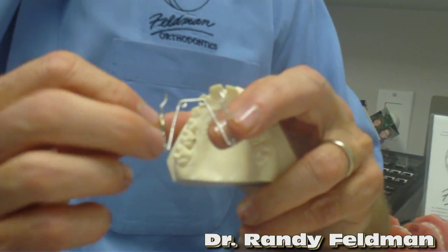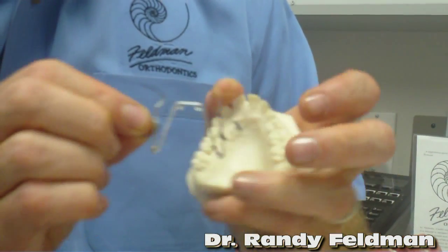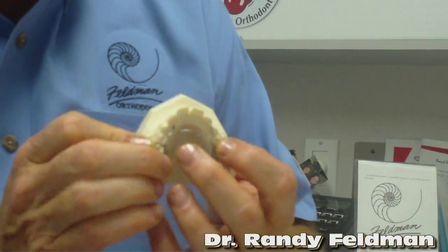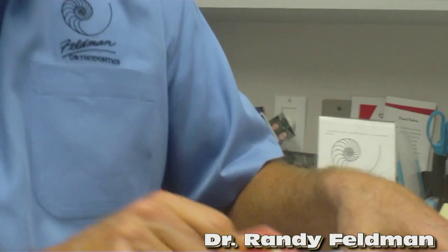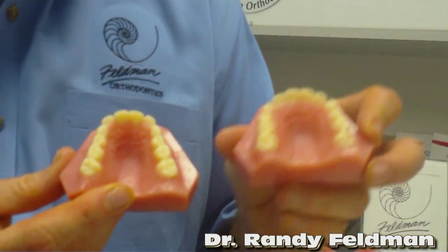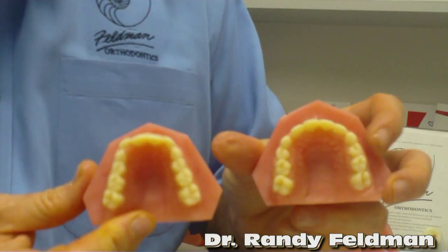Quad means four — one, two, three, four — and every one of those little circles is called a helix. What we do is we expand it, compress it, glue it in. It doesn't hurt the child, it doesn't look funny, they don't talk funny, there's no key, it doesn't have to get the parents involved. It slowly and gently widens or expands the upper jaw. You can see the before and after — the child has expanded tremendously and the upper front teeth have lined up.